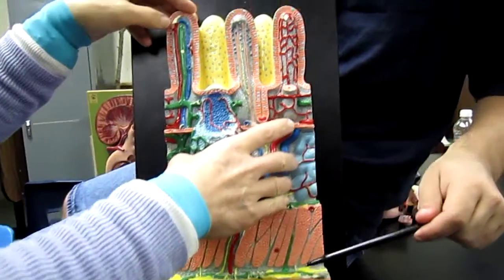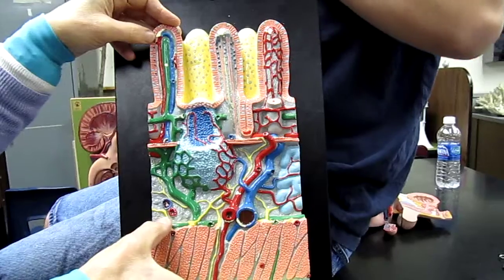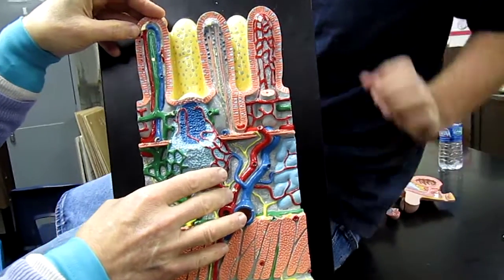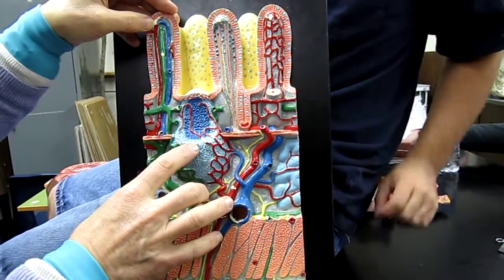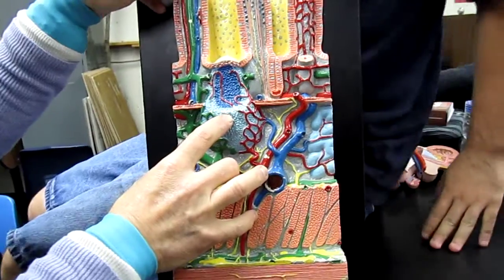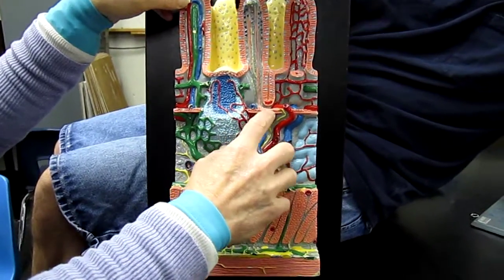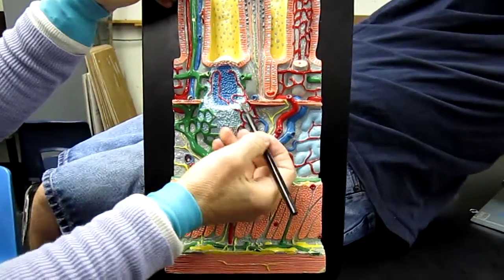And then right here, as we move inward from the muscularis externa to the submucosa, the submucosa is going to have special things in it that will include the Peyer's patch here, and the outer aspect, the distal aspect of the small intestine called ileum. And then notice right here, we have the muscularis mucosa. I'll use the pen. Muscularis mucosa.